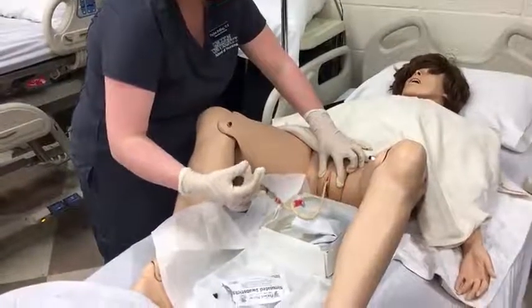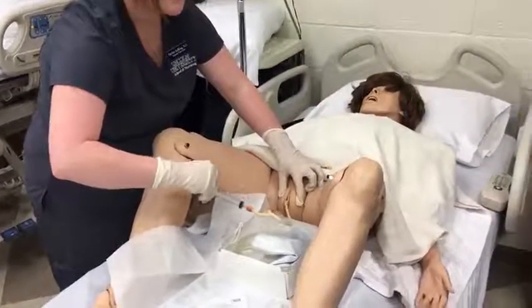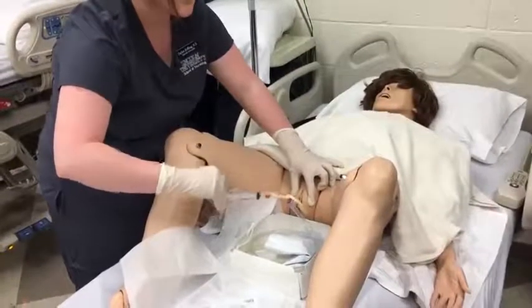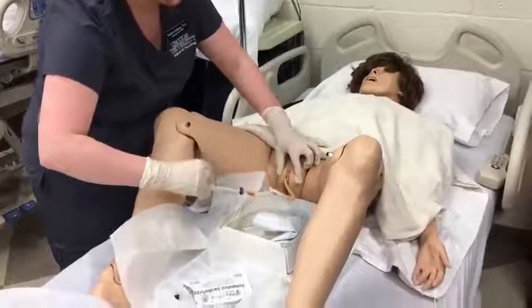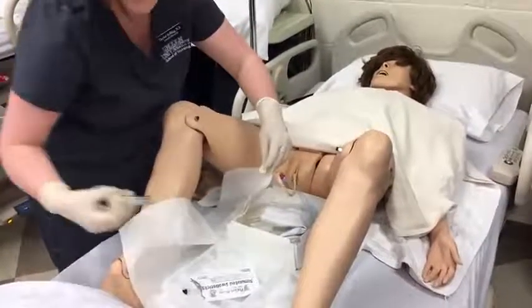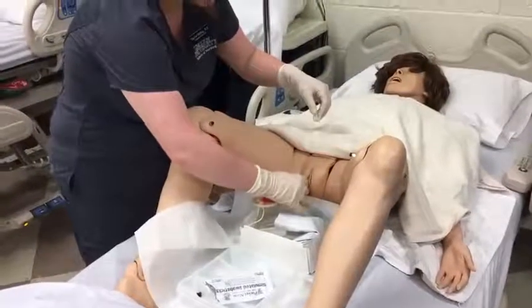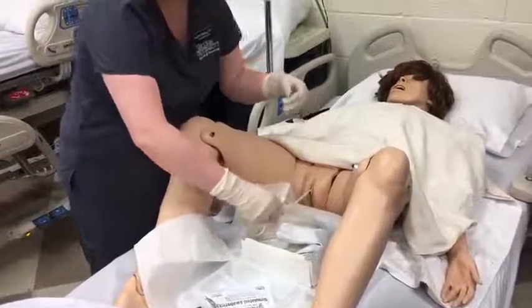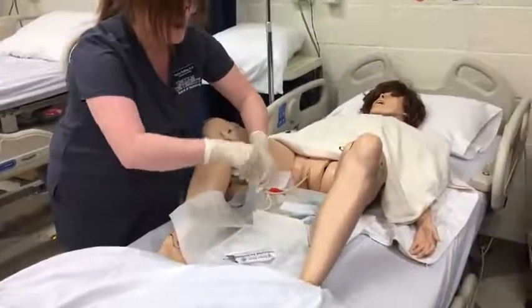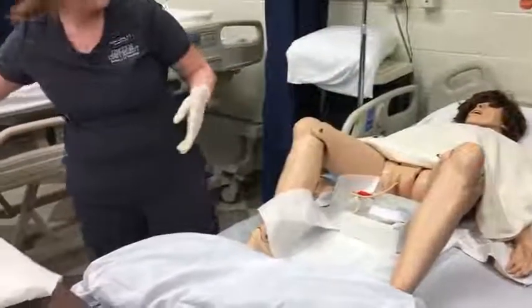Now I'm going to inflate the balloon. You want to put the full 10 mils in there and make sure that you document that so that whenever they remove it later, they know the amount that should be coming out. Now that I've done that, I'm going to remove the syringe and discard it. I'm going to tug slightly just to make sure it's in proper position, which it is. Then I'm going to discard all of these supplies here.